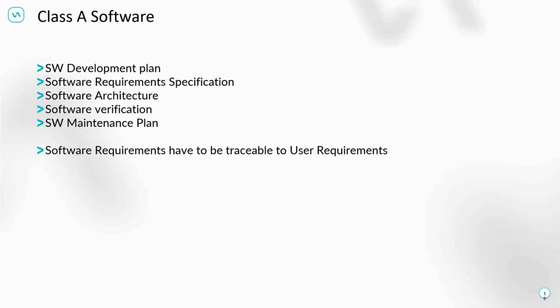So all requirements need to be covered by the verification, in an N-to-M relationship. You can have one test which fulfills multiple requirements, or you can have multiple tests which fulfill one requirement. So it's not only one-to-one, and that's not needed, but you can do that in a different way. Always remember that your requirements need to be traceable. So software requirement traceability is one of the main steps to be used in addition. Verification and software requirements will lead to each other's traceability.